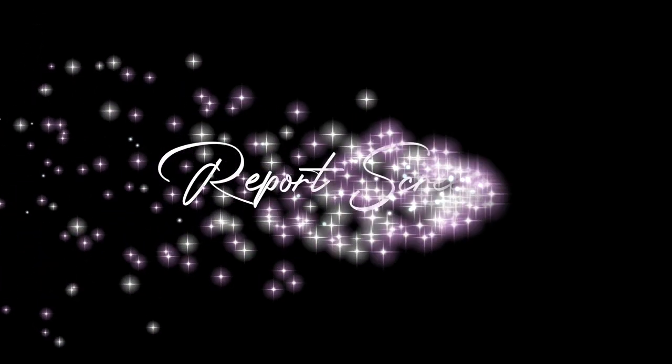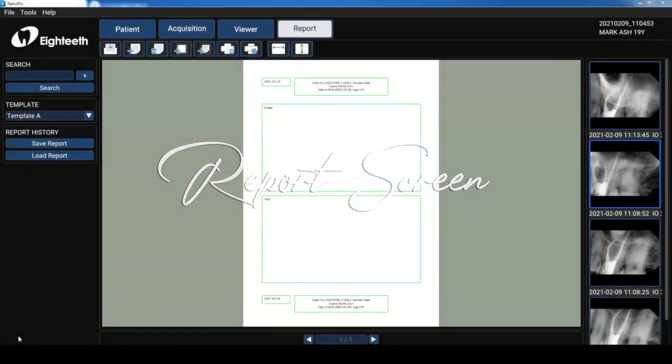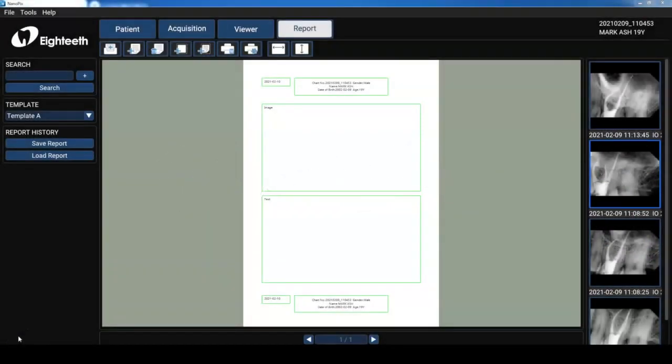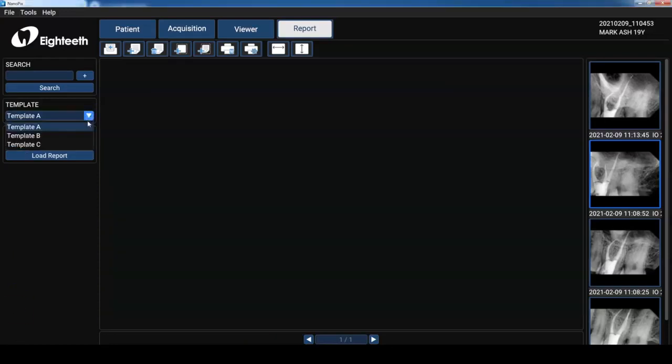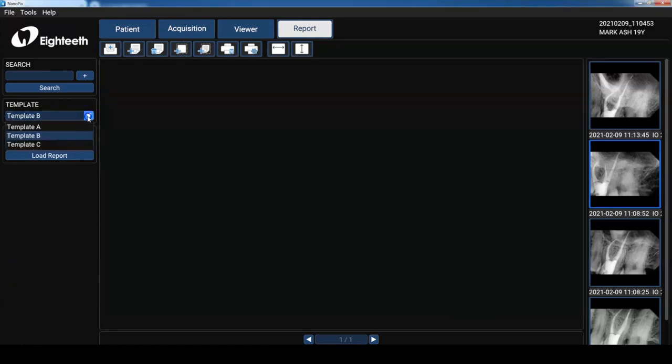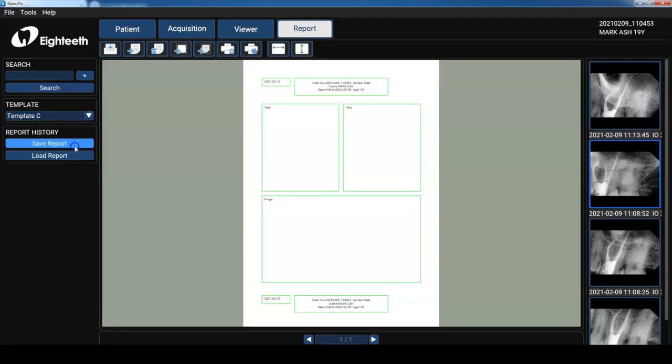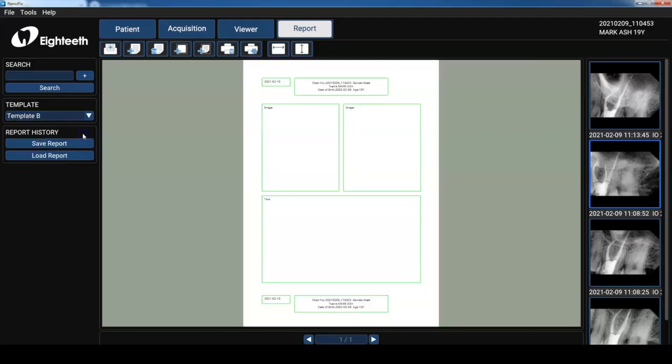In the report screen we can create reports and automatically import radiographs into that document. There are three different templates to choose from and I can customize the reports according to my needs. Okay so let's take a look at some of the functions. This is template A. It has an image on top and a text box below and then template B has two images and a text box below and then template C has two text boxes up top and an image below. I really like using template B.